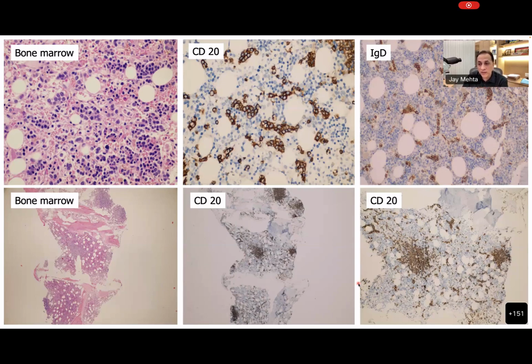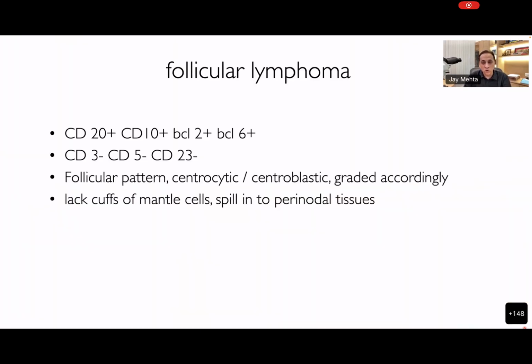Then what will also help you is, again, with this nodular proliferation here, nodular infiltrate rather, you can see this intrasinusoidal localization of these lesional cells on CD20, beautifully highlighted by the B cell marker. So that's something which will help you diagnose SMZL if you have only the bone marrow to study.